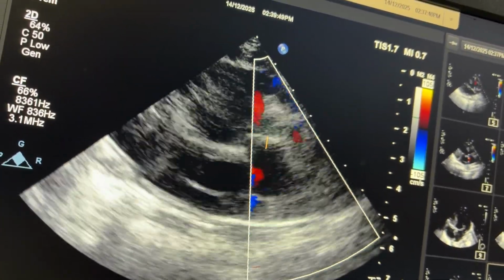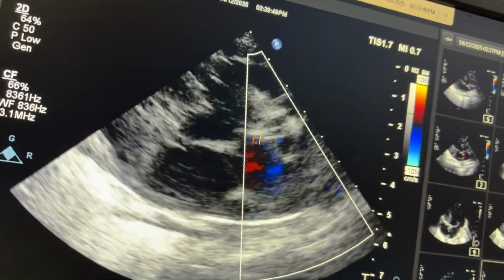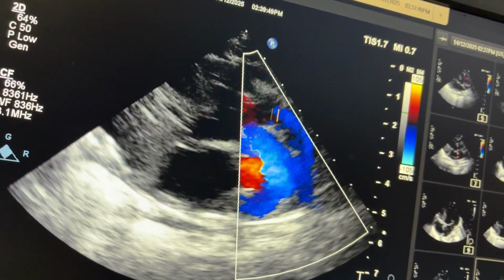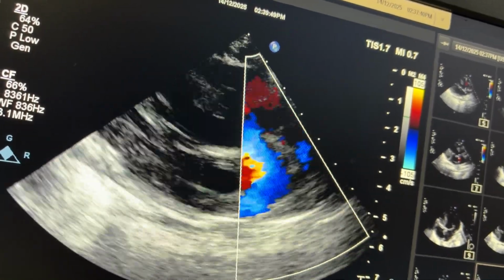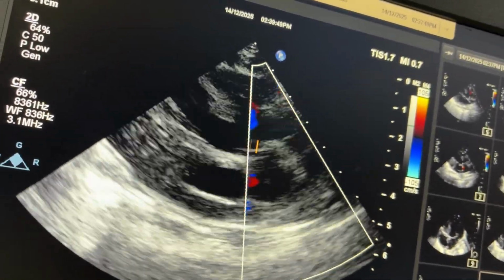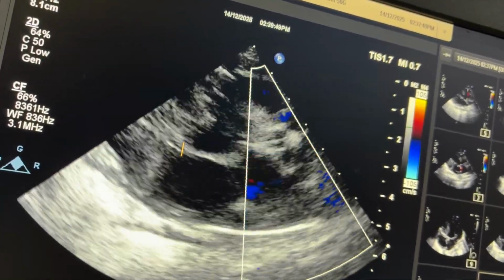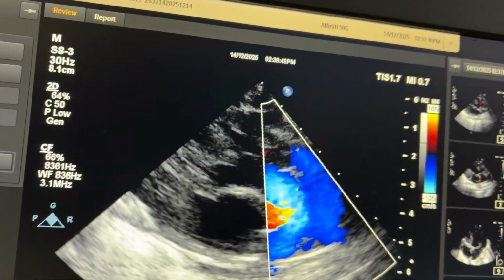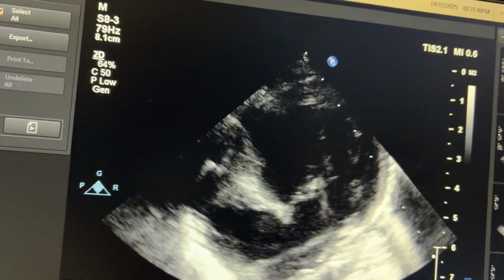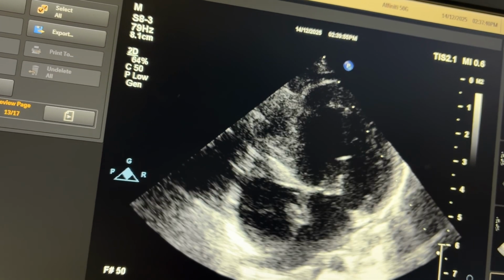So this is pulmonary artery, that upper one is aorta, and both are parallel, especially in the initial part. So whenever you find parallel, that means transposition. And in this case, as the LA is connected to LV, so this is called d-transposition of great arteries. Again, four-chamber view.